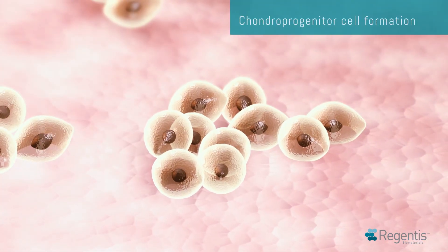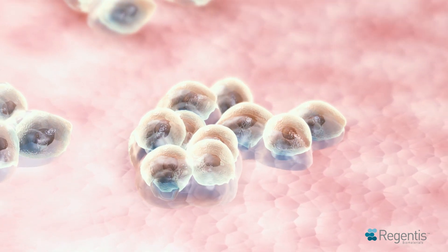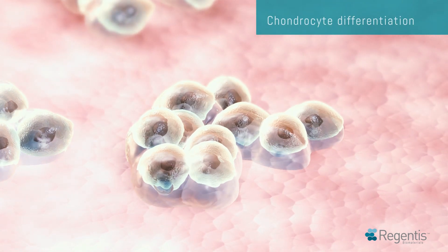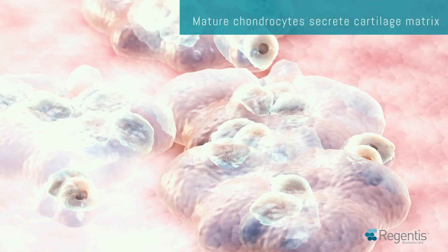The aggregated stem cells on the Gelrin-C surface gradually differentiate from chondro-progenitor cells into mature chondrocytes, secreting cartilage matrix and forming healthy hyaline-like cartilage.